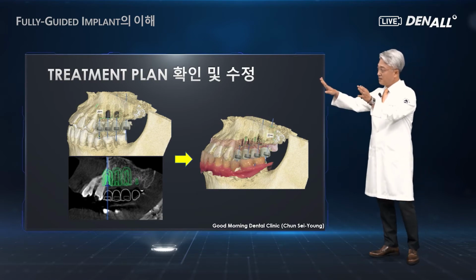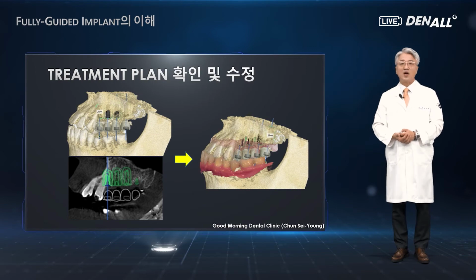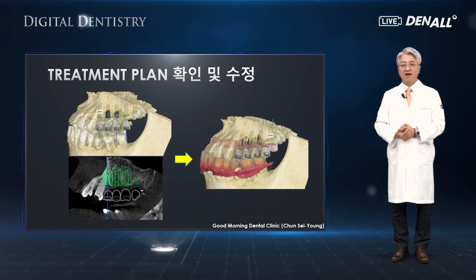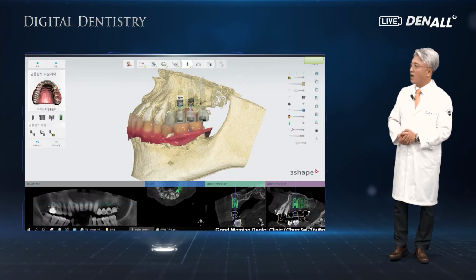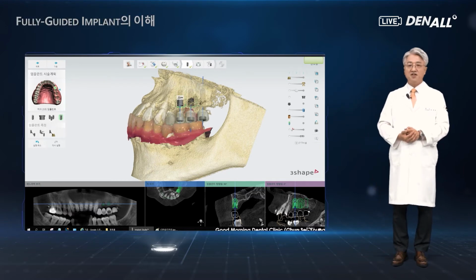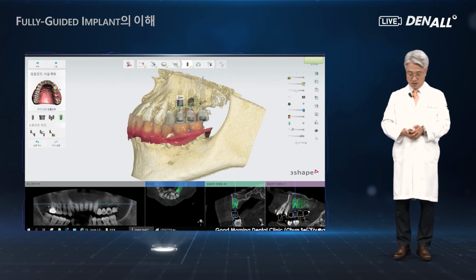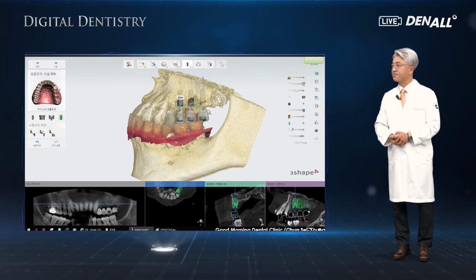So next, everything is inclined distally. Implant placement is okay, and the prosthesis is okay as well. But among the prosthesis, abutment, and the fixture, the relation is not physiologically stable. Therefore, I boldly decided to remove the number 24 implant and use 3 implants. The prosthesis with the cantilever bridge is designed, and I decided this would be the ideal, the optimal implant design.